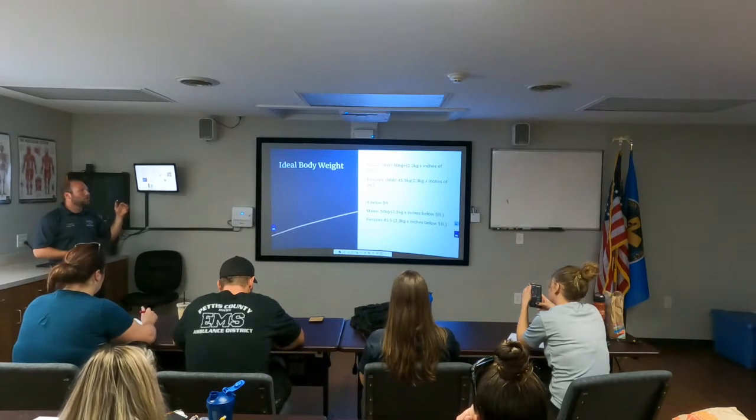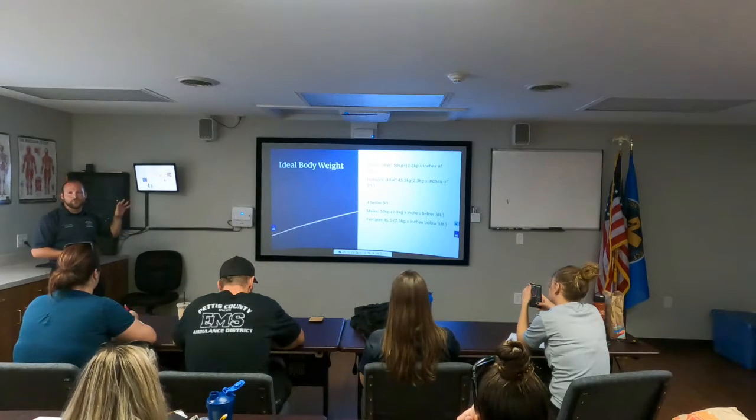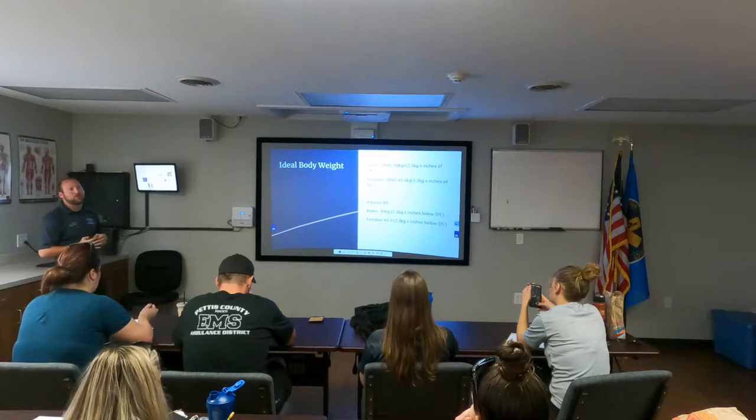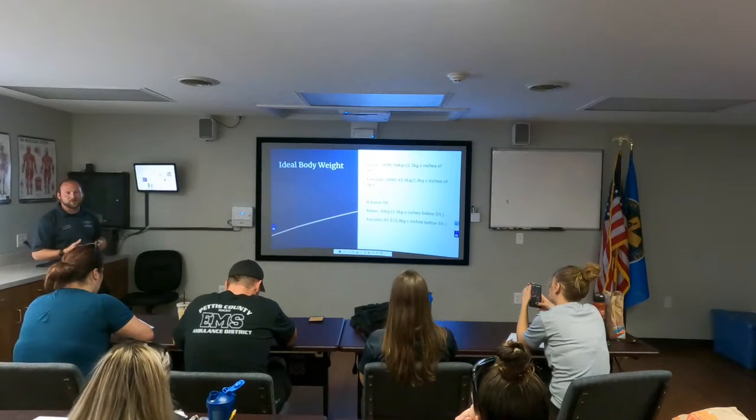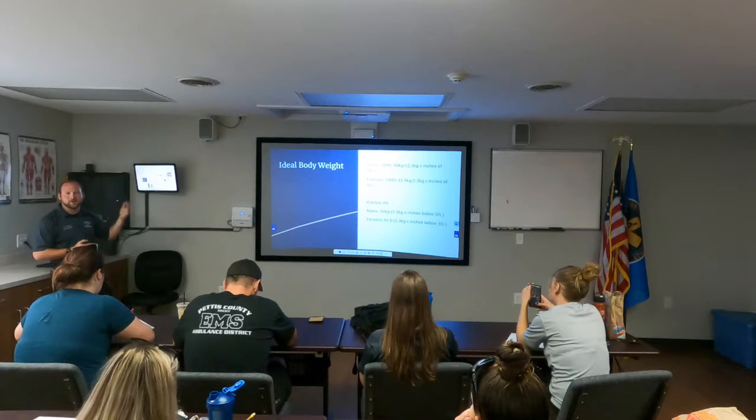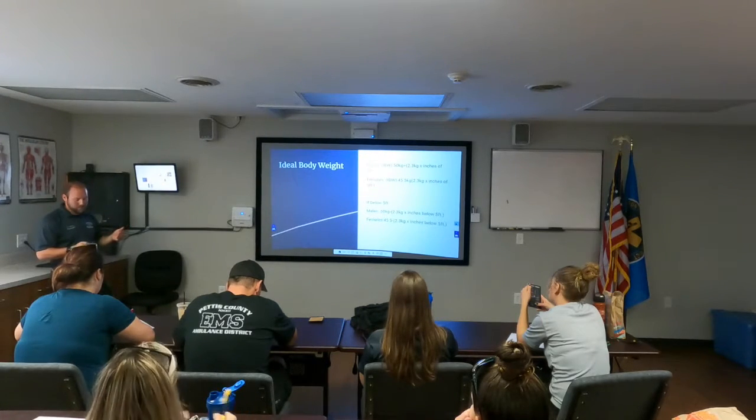This only works down to about 4 feet. If you have anything less than that, we're talking about pediatrics, there is a whole other setting, a whole other calculation that you can use for those individuals, but it's not too far off of what the ideal body weight is for our pediatric patients.